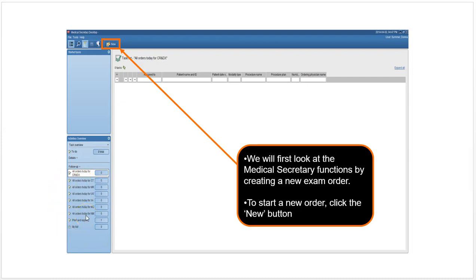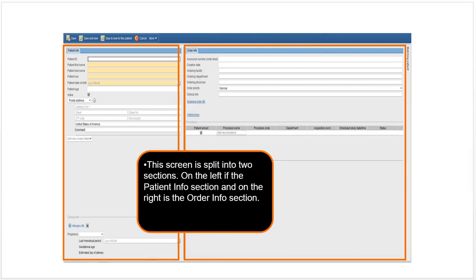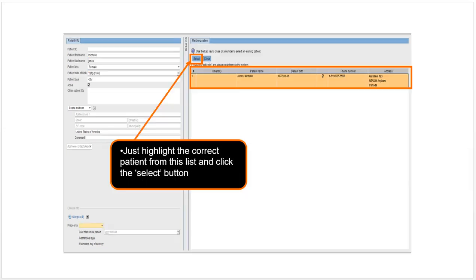When you go to create a new patient, you have two sections: the patient info section here and the order info section here. The patient info section contains all the information about the patient. The order info section contains all the information about the order.